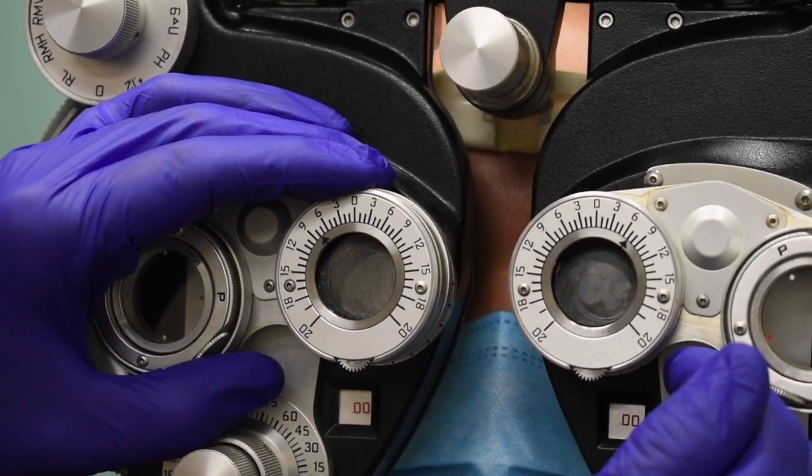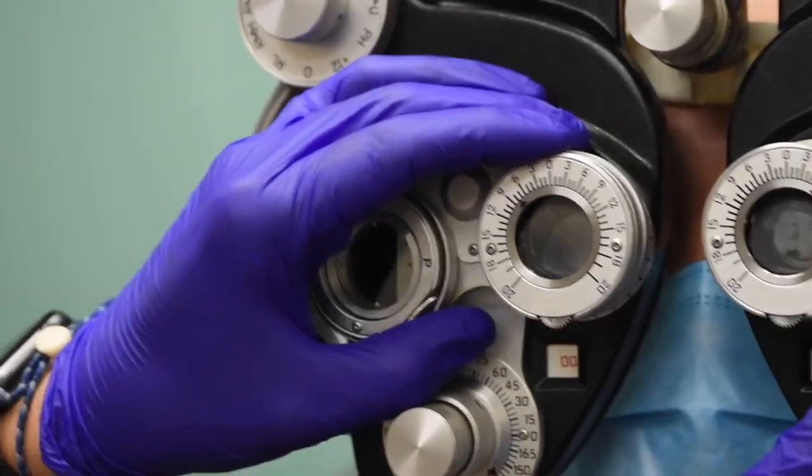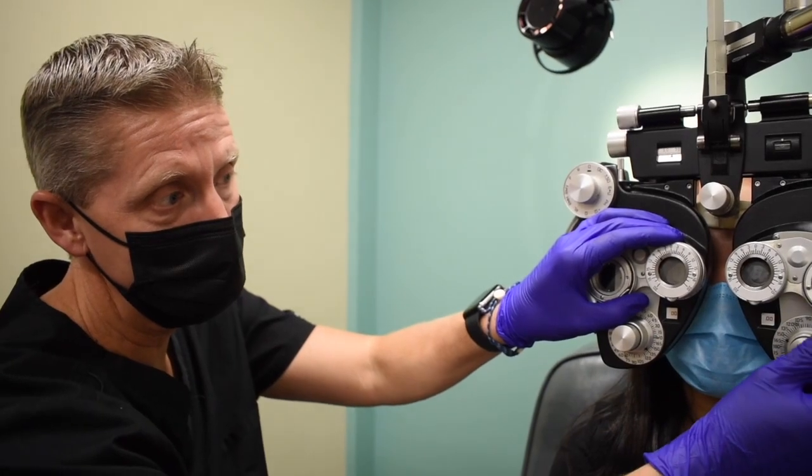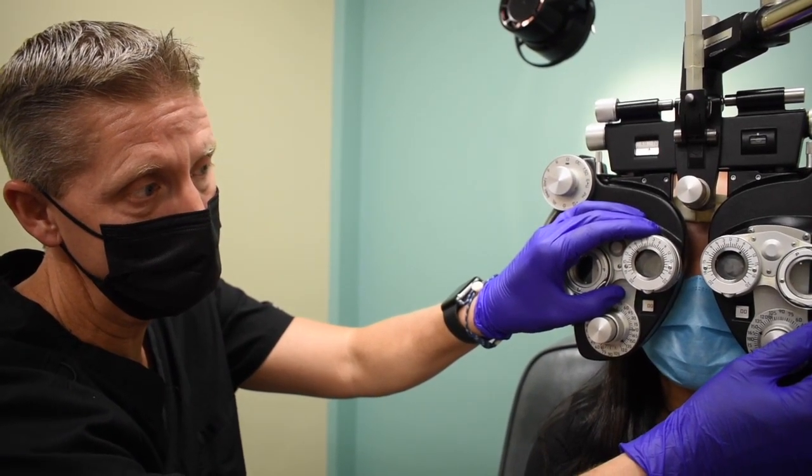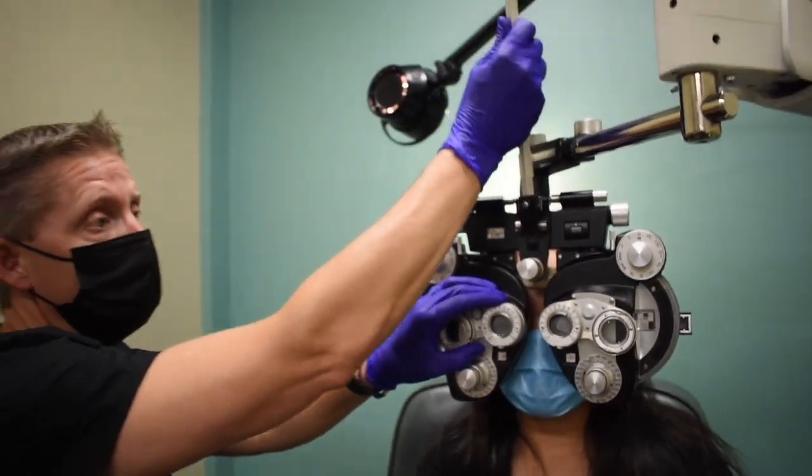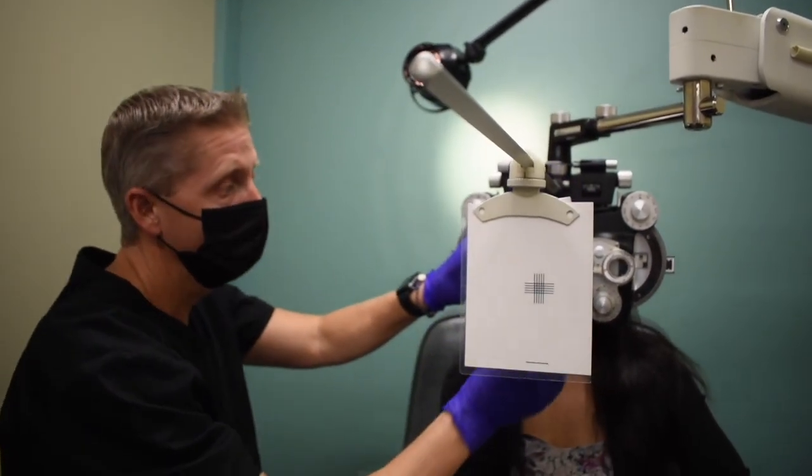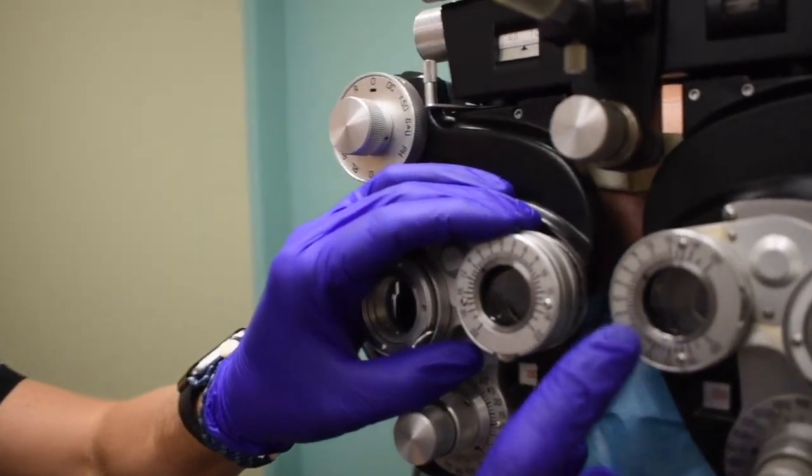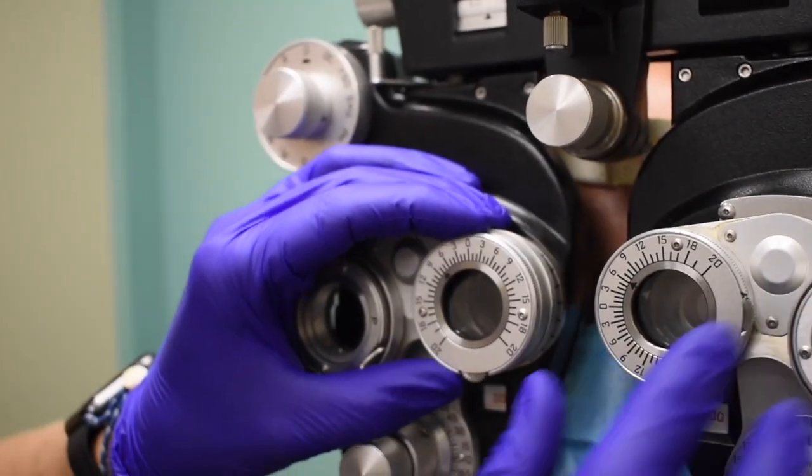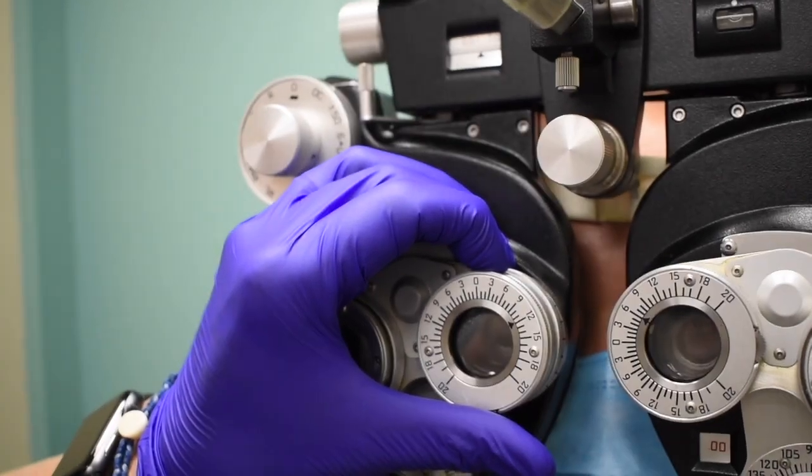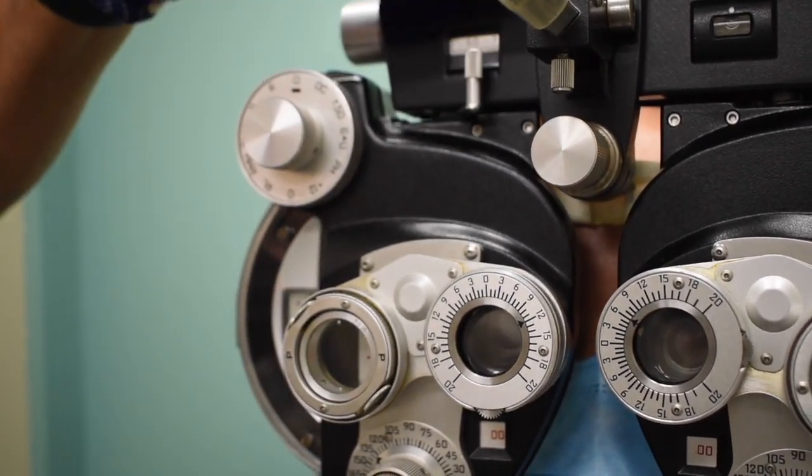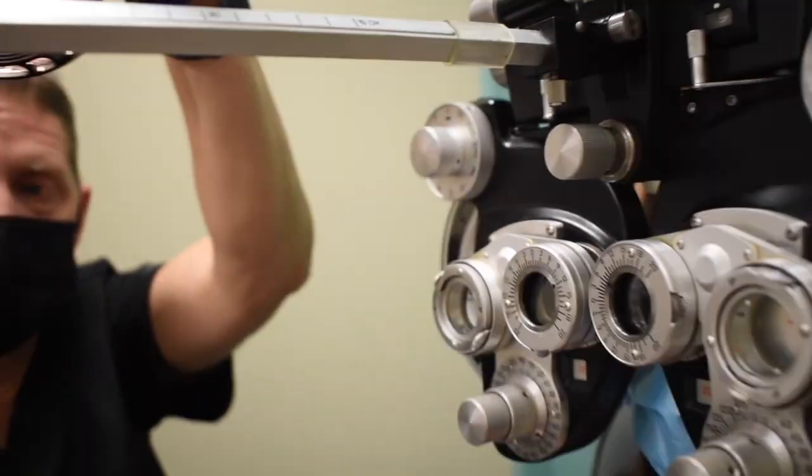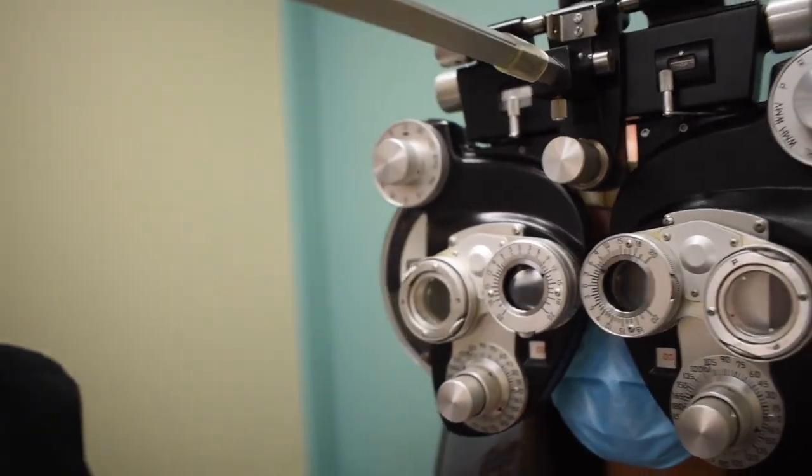So now we've done our horizontal and vertical phorias. We've done our vertical and horizontal vergences. Now we'll roll into our near point testing. I'll have you close your eyes again, Phoebe. To do that, we're going to drop our reading rod down. We're going to do our phorias and vergences at near first. I'm going to rotate my lenses and get them set up. So I've got 6 base up OS. I've got 12 base in OD. I'm going to rotate my PD in. I'm going to bring my overhead light on. And I'm going to have Phoebe go ahead and open her eyes.